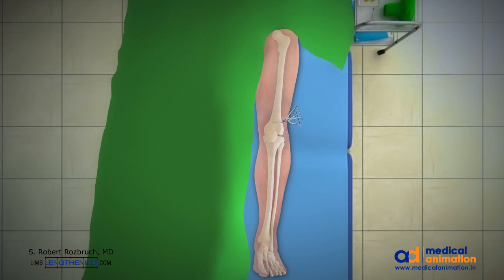You'll notice that the open wedge corrects the valgus deformity, and this is checked in the operating room with a hip-to-ankle line.